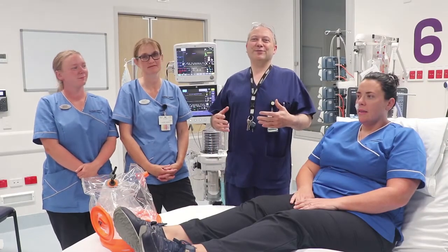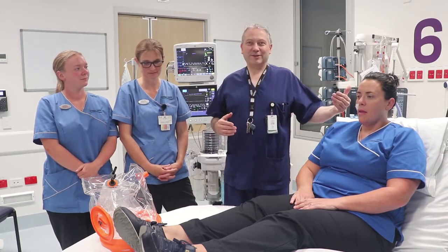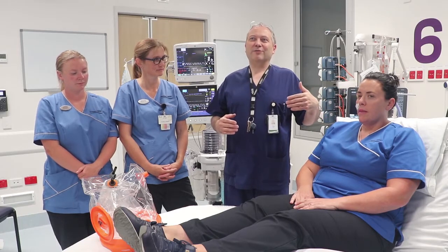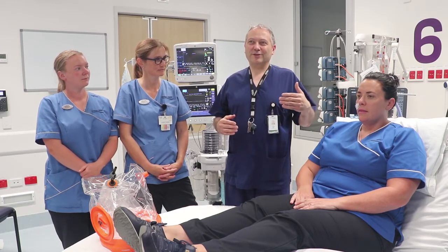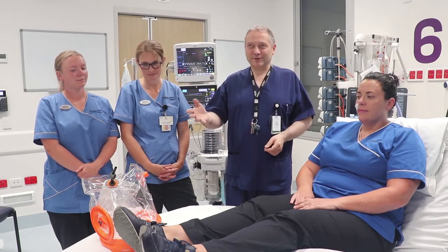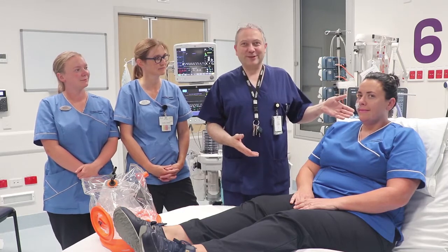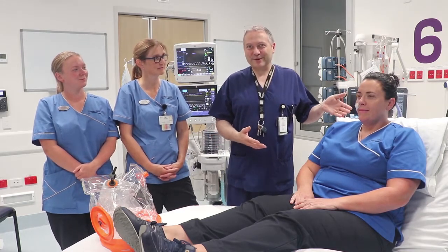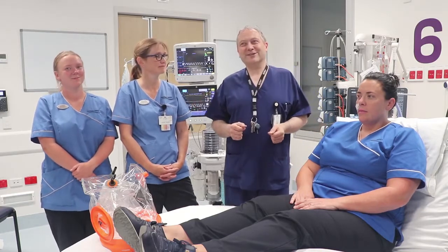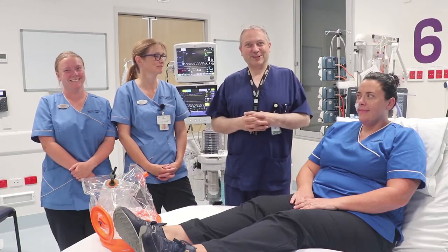In these videos we're going to teach you how to monitor capnography inside a helmet, and then show you how to administer supplemental oxygen within one of the SUSE hoods. Today we've got Carla, who has very kindly volunteered to be our patient, and I have Louise and Sarah, two of our nurse educators, working with me to go through this process.